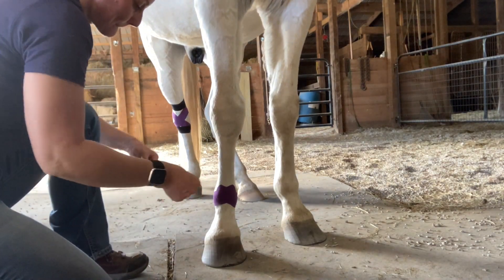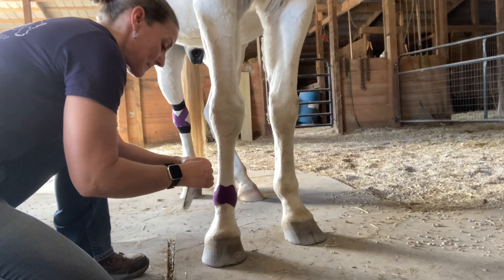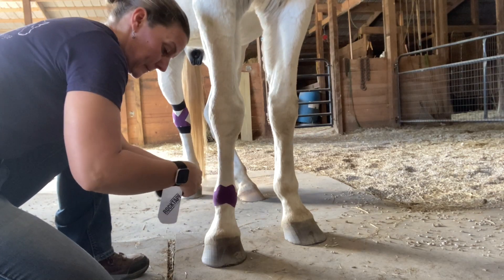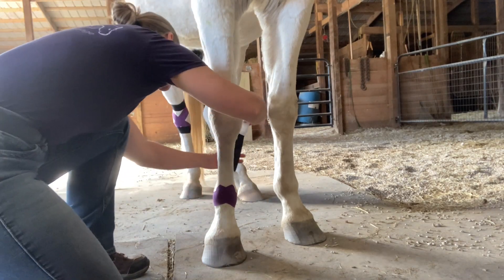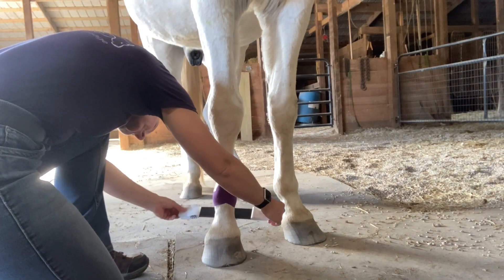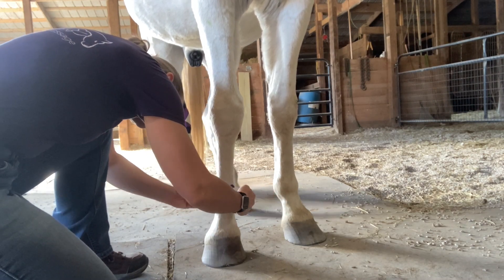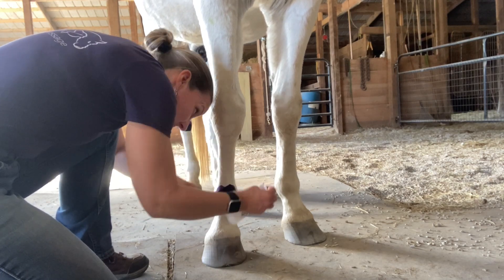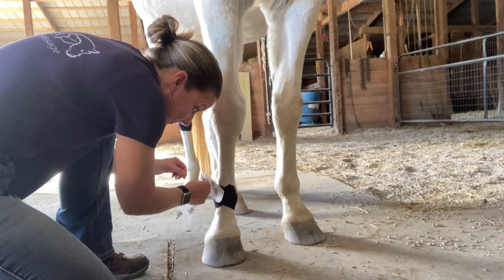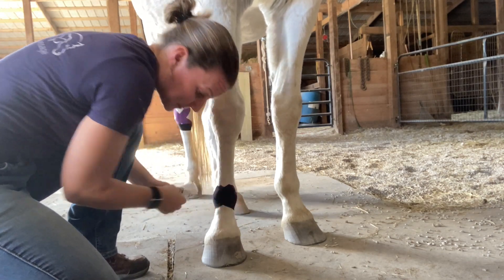The second eye tape is going to act as the anchor to the first eye tape. Same thing — center break, backing to the ends, mild stretch. You're going to apply this one about halfway down the first one. Mild stretch along the back, no stretch overlapping your ends in the front, crossing them over. Give them a little rub.